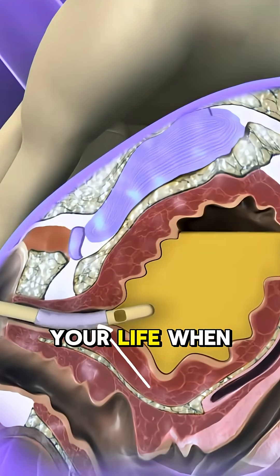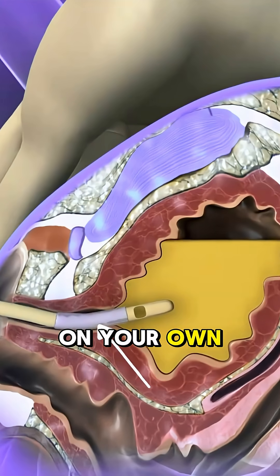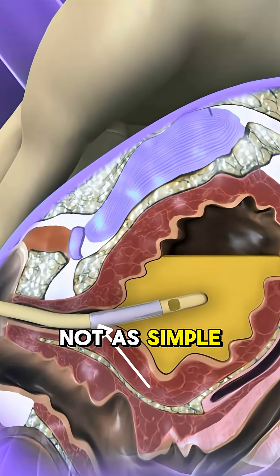This tiny tube — it can save your life when you can't pee on your own. But inserting it is not as simple as it looks.